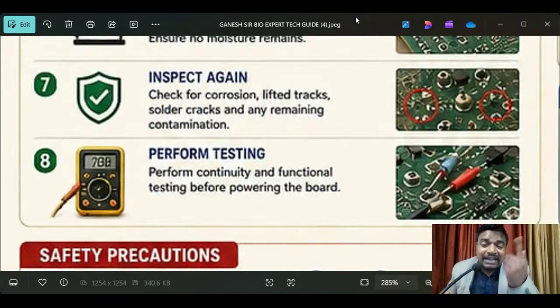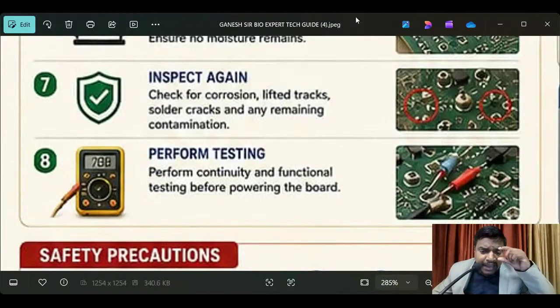These are electronic components. If they touch even a little bit, it is going to blast. Short circuits will happen. So don't ignore small mistakes, and by using binocular glasses, you will definitely catch it. Okay, right.